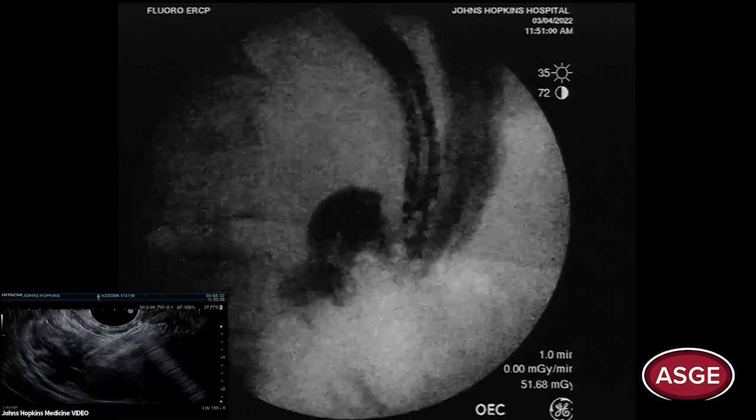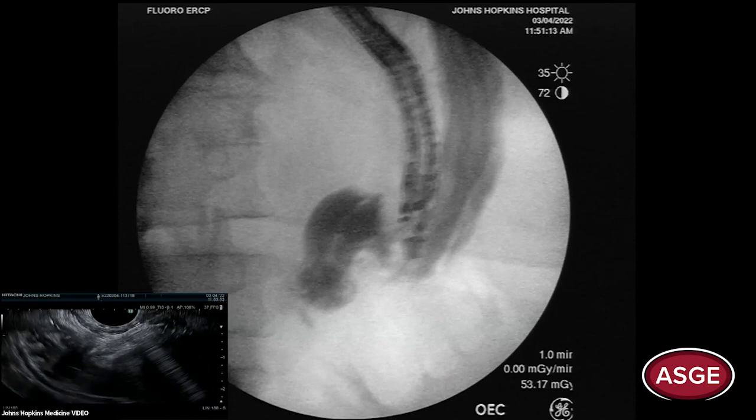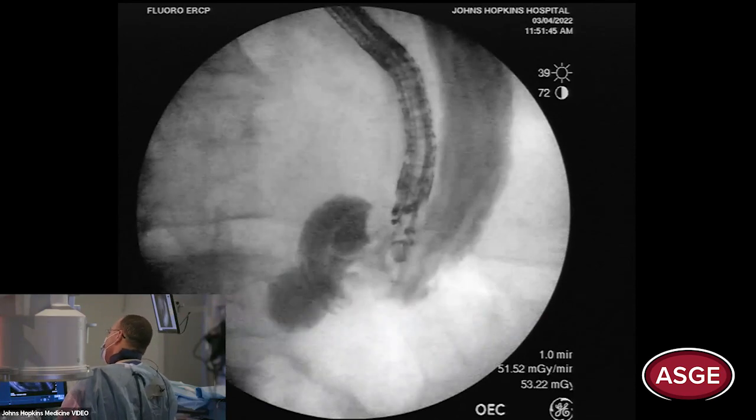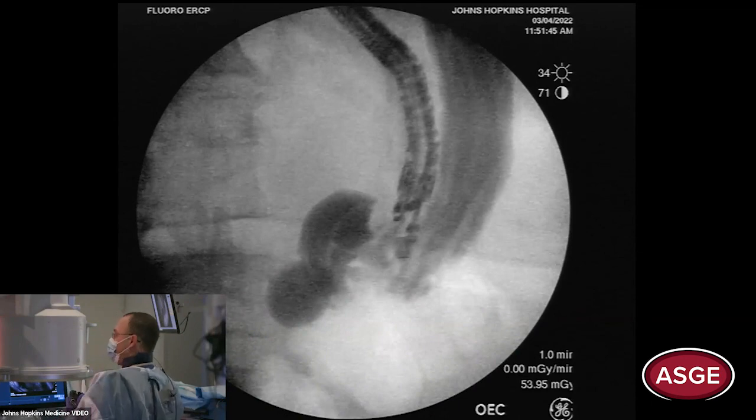Our job now is just to fill — it doesn't matter where the puncture is initially. Usually the first puncture ends up in the antrum. What you want to do is pull the scope back and point it toward the body. You don't want to be too distal, and you don't want to be too proximal because the fundus is very vascular. The body is perfect. Now we see the stomach being filled.